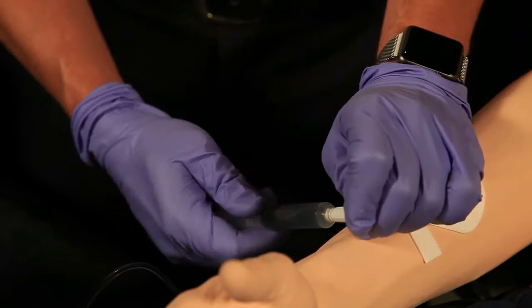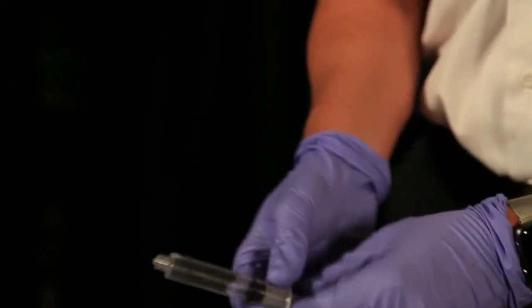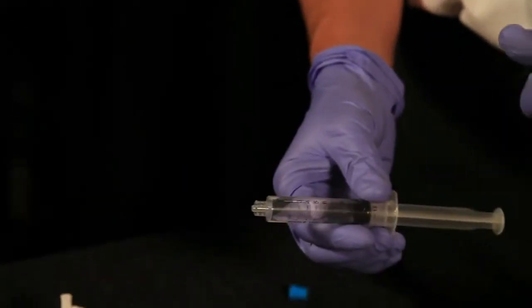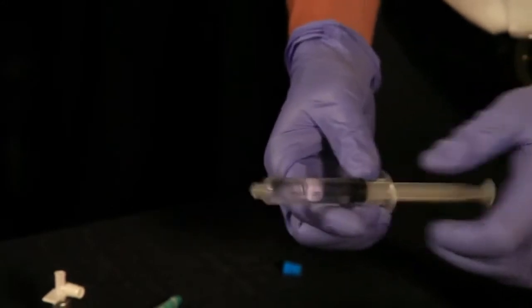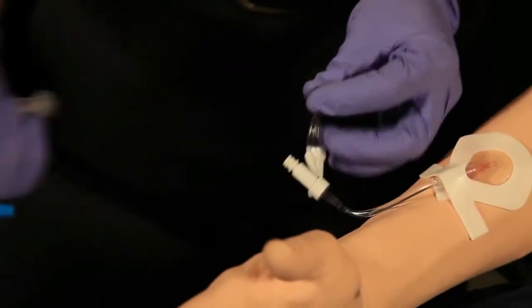Okay, I'm going to go ahead and pinch that off, make sure we have all the air cleared out of the syringe. Now we have 10 mLs total in the syringe, and it's actually going to be 200 milligrams of ketamine in here. So we're going to go ahead and pinch off to the IV bag.